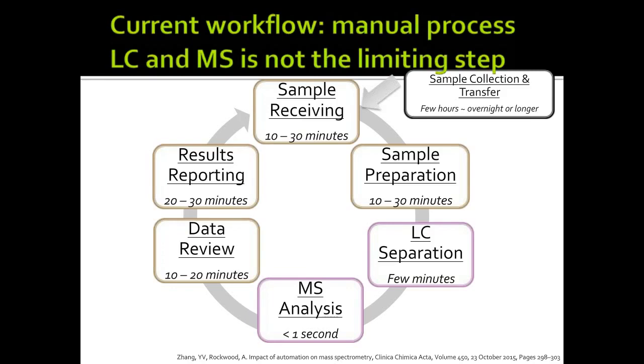And then data reporting, if you don't have the interface, takes more time as well. So although the current workflow's focus is really on sample prep, before and after LC mass spec, that introduces a lot of labor-intensive functions.